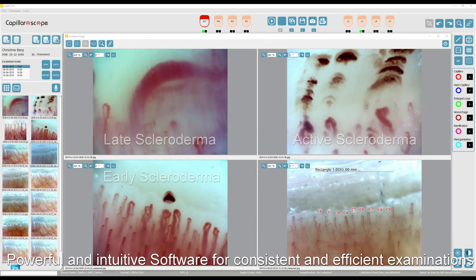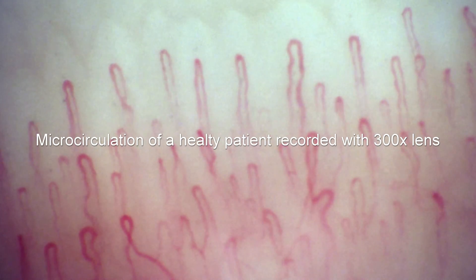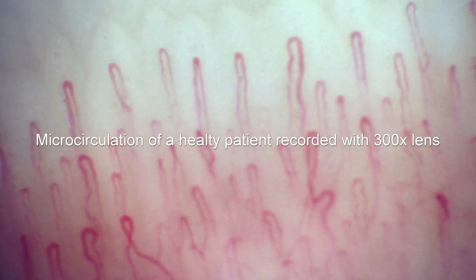A powerful and intuitive system for consistent and efficient examinations, reporting and follow-up. Display and record video images of blood circulation with a 300x lens.